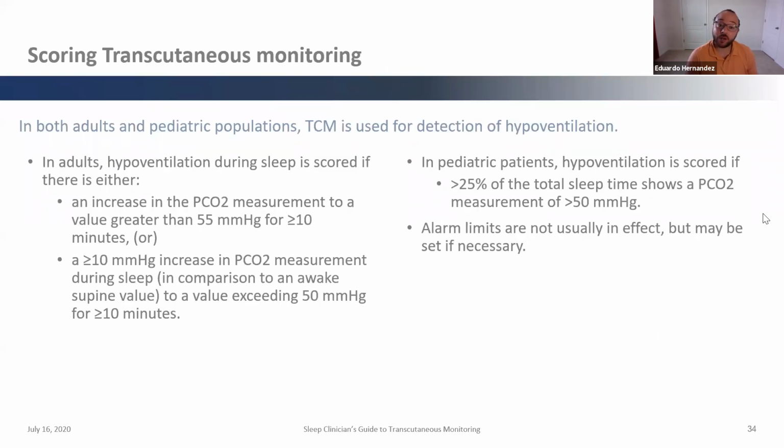So jumping to the scoring technologists, we talked about acquisition. Now scoring, there are some very specific standards and measurements of how doctors interpret, narrate and diagnose hypoventilation, and transcutaneous monitoring is a very important way. And again, it kind of goes back to the acquisition technologies.